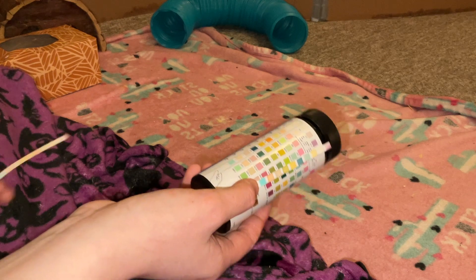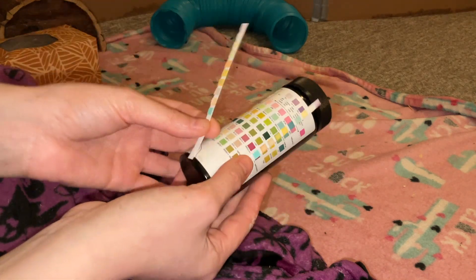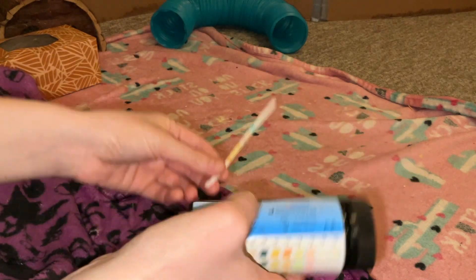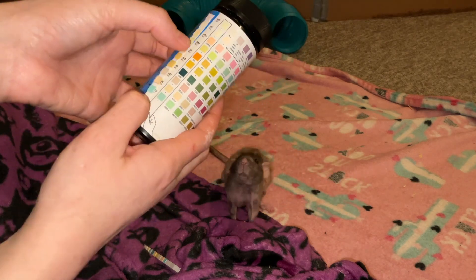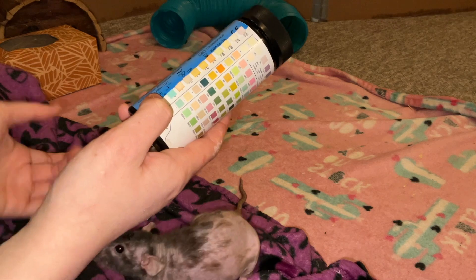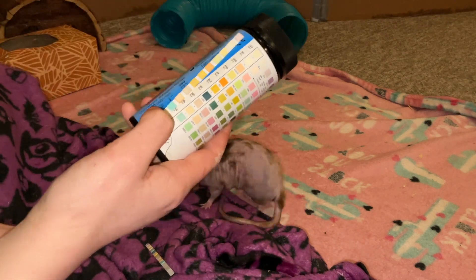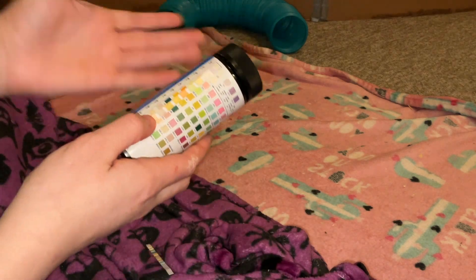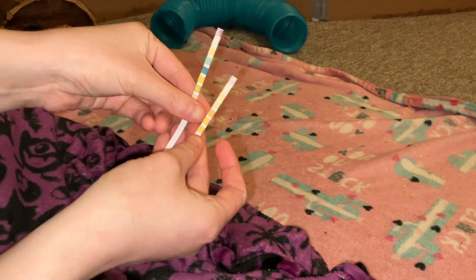For comparison, I also did a urinalysis test on Blueberry, another one of my rats who is healthy. You can see her result here — comparing the strips, her protein shows nothing in her urine, unlike Donut, and her pH is much lower. Everything looks a lot better in Blueberry's case, especially when it comes to her kidneys. You can see these two strips side by side — Blueberry's is this one, and this is Donut's.